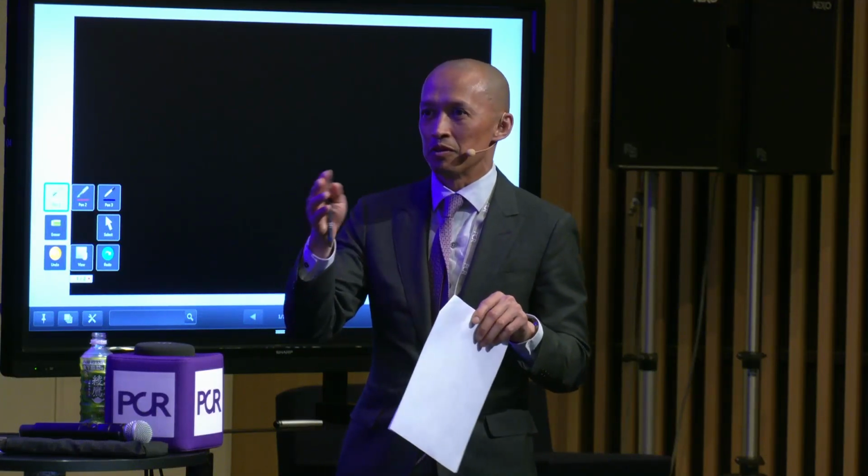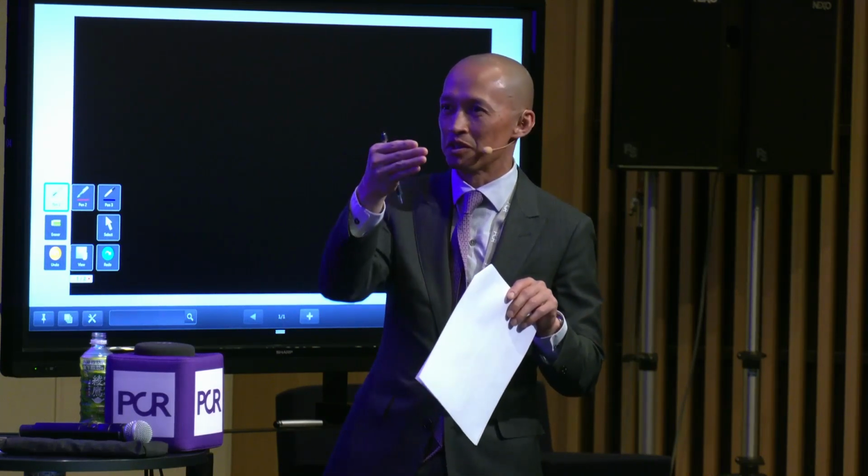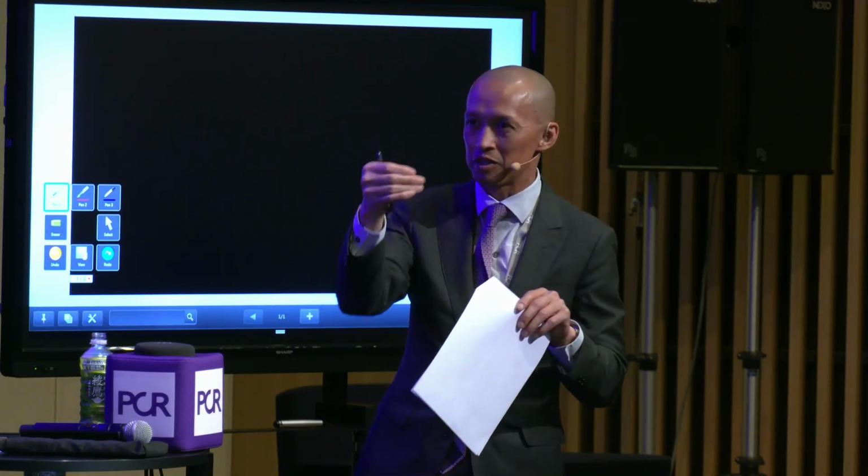Yeah. For those of you who have tricuspid experience or are looking at tricuspid, it's the same for the septal leaflet, because the septal leaflet's always curled, or almost always. You have to create that trajectory.